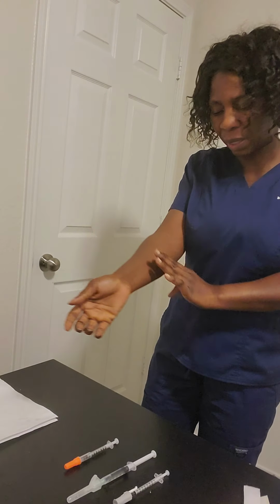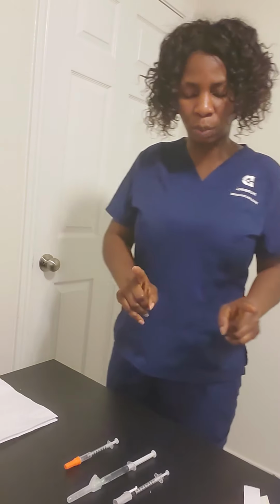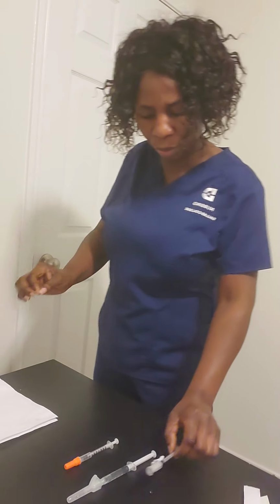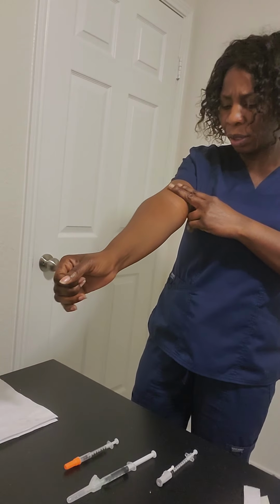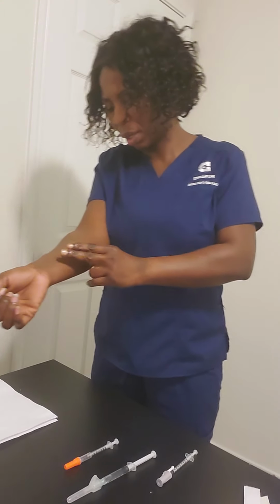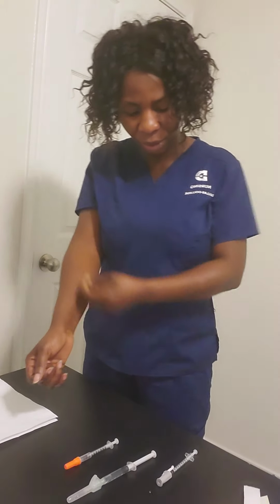Then I'll be locating the site where I'll be inserting my injection. But to administer these 3 injections, I'll be starting with the least painful to the most painful. So the first injection I'll be administering is the intradermal injection, which is the PPD. I'll be going into the anterior forearm, using 2 to 4 fingers below the antecubital space, and it's going to be one width above the wrist. So it's going to be within here. I'll make sure that the needle is visible in the skin when I'm inserting.